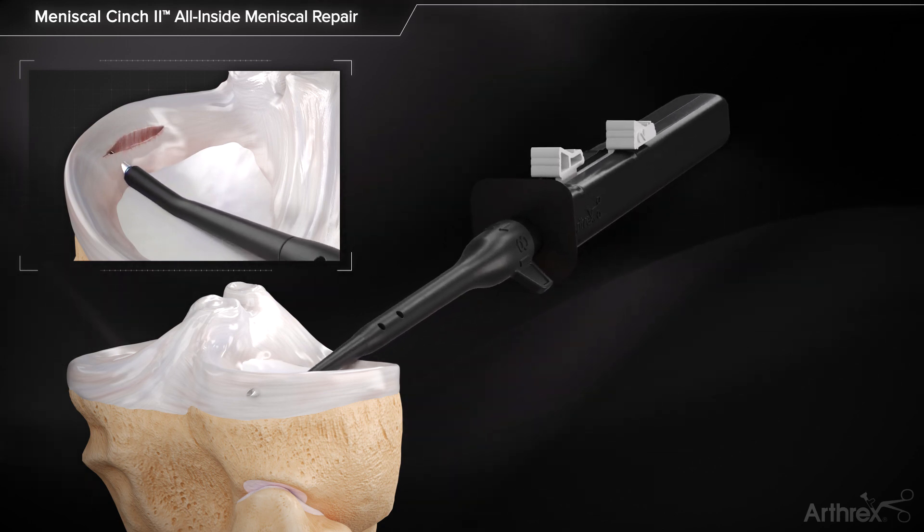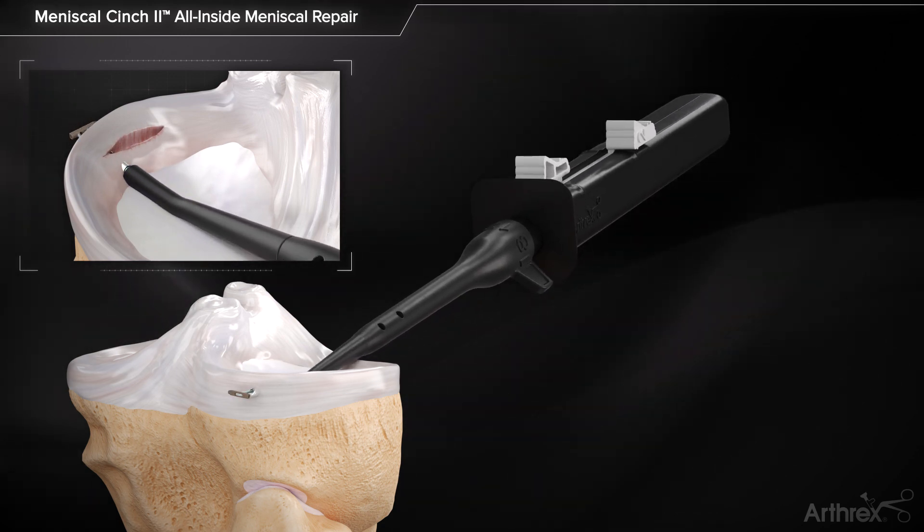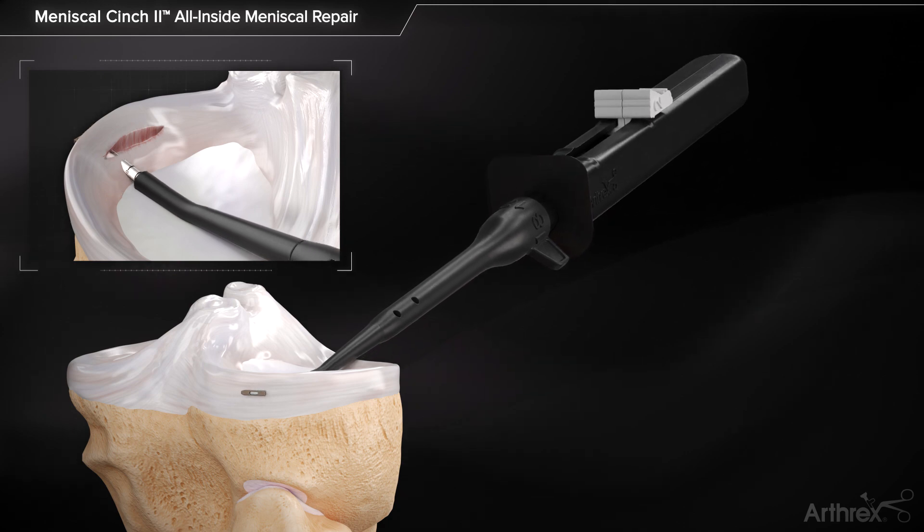Completely advance button number 1 to deploy the first implant. Retract button number 1 until it is in line with button number 2.